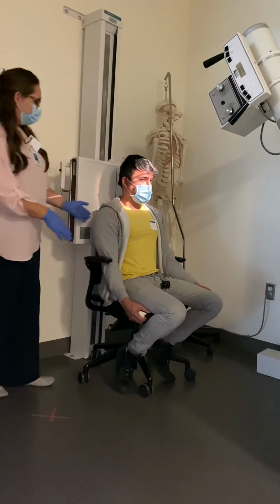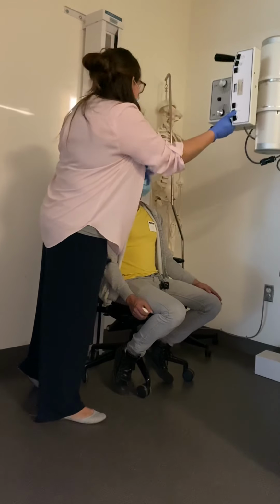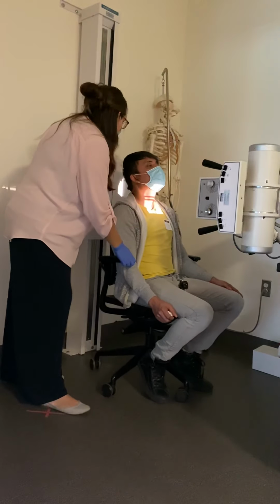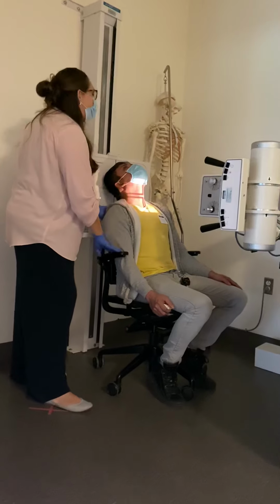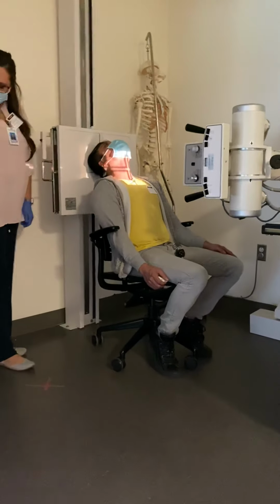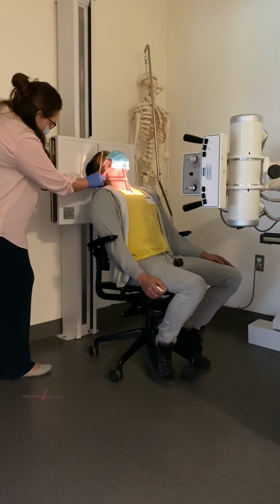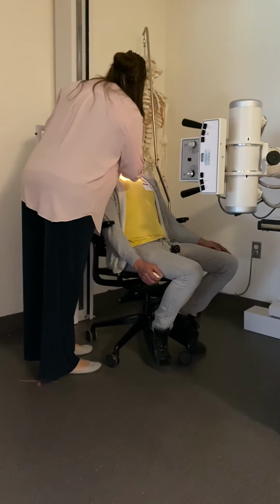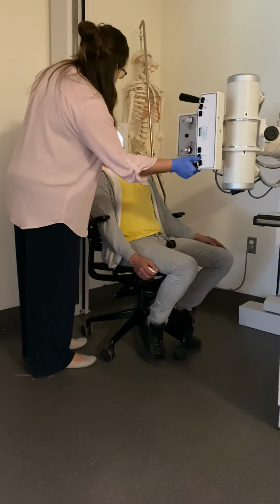After the AP Towne's, you can relax. I'm going to do the SMV. So I'm going to take my angle off. I'm going to have my patient scoot out about 12 inches away from the board so that they have space. I'm going to have them tip the top of their head back until it's touching that board. I want to make sure now that the IOML is parallel to the IR. I need to make sure that there's no rotation in my patient. Can you bring your chin up a little bit more? And then I'm going to center midway between the angles of the mandible.